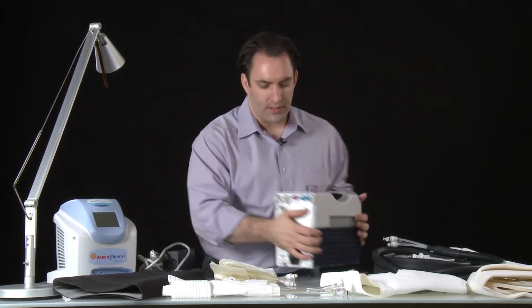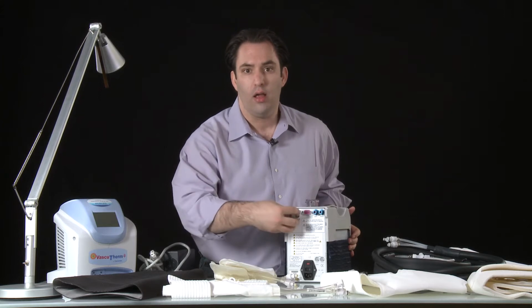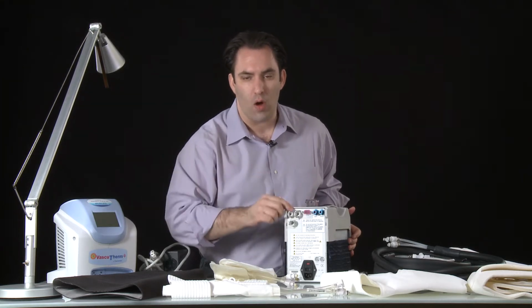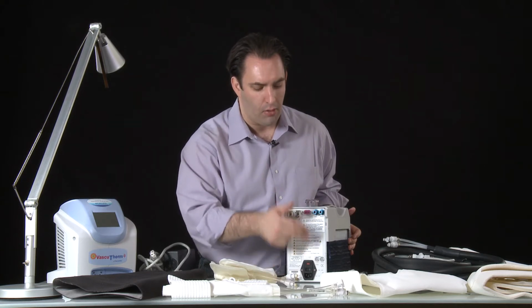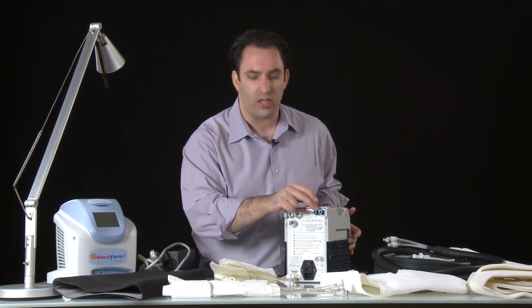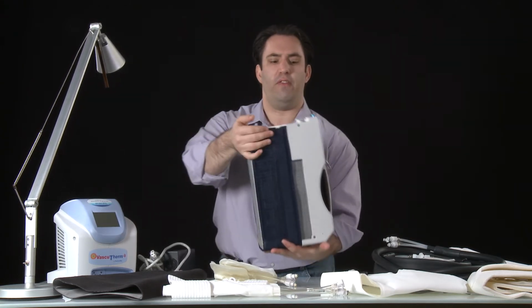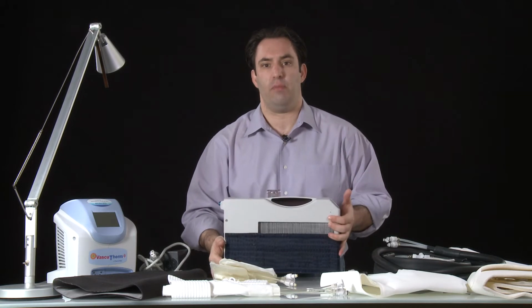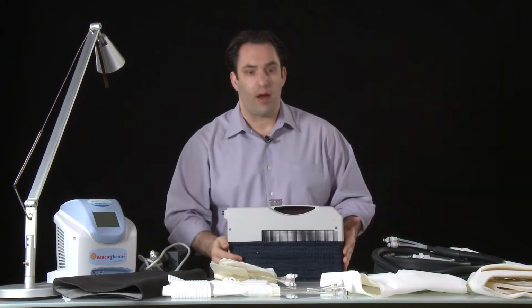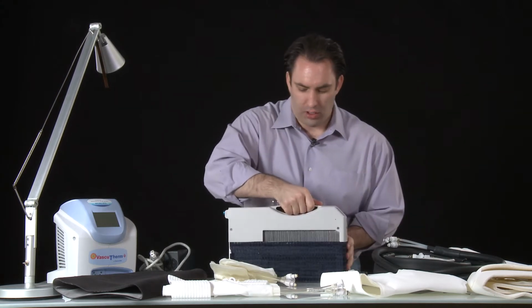There's another couple of ports on the back, so just to give you a sense, those three lines are water, water, air: an outgoing water, incoming water, and then a compression line at the particular joint. Power line, power on off, and there's a left and right here for foot or calf compression. That's for deep vein thrombosis. I've got a filter around the side, a couple of buttons in front, pretty straightforward unit.